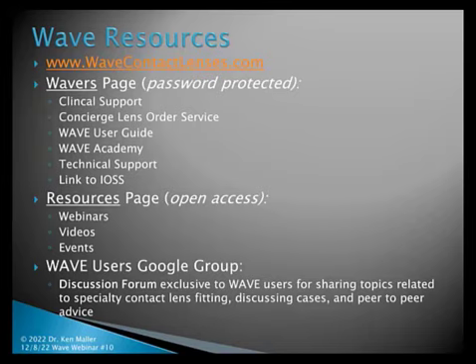So there is an absolute order that you need to make changes so it makes good, consistent sense, and you do end up with a lens that's exactly what you wanted or intended to come up with. But you do have to understand a little bit more about how Wave is applying all those changes. The idea behind the modification area is really to try and streamline that and make it a little less mysterious, so that you can come up with the changes and still end up hopefully right where you intended to be.